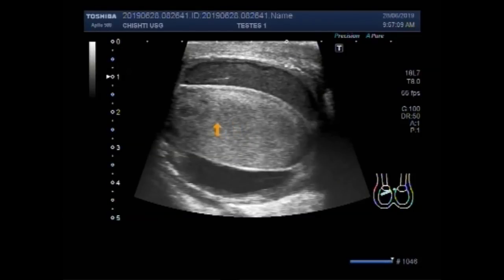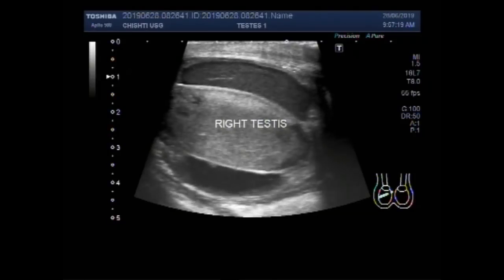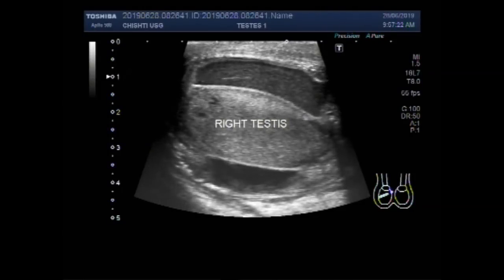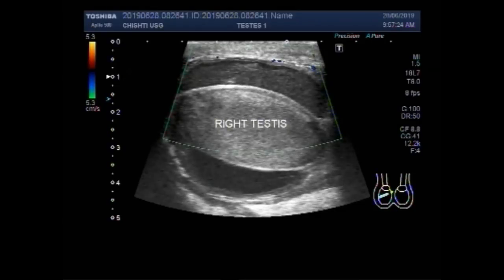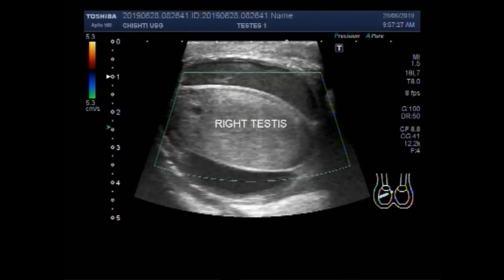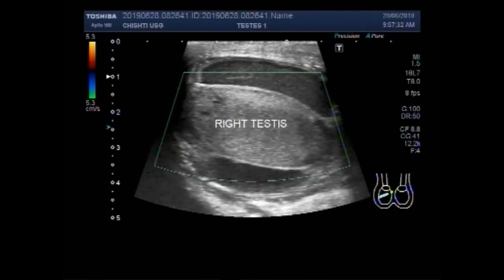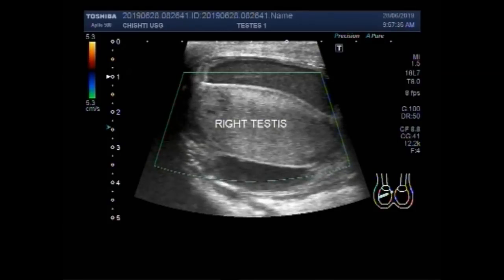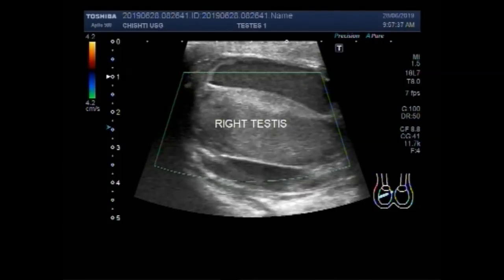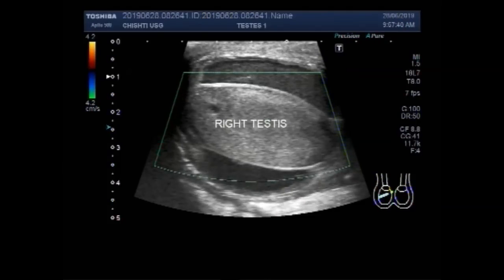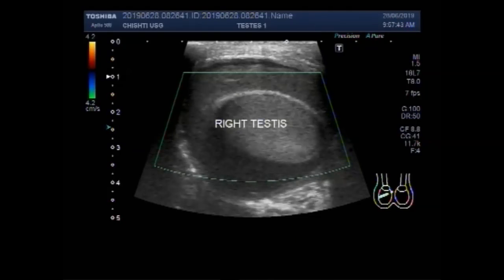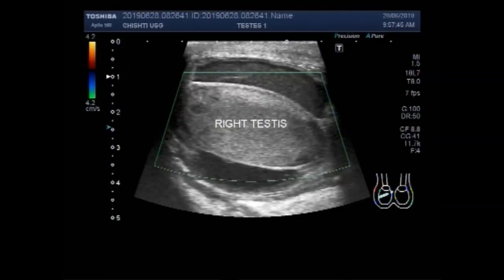This is the right testes. Now you can see there is no blood flow seen in the right testes. So this is a case of torsion of testes.